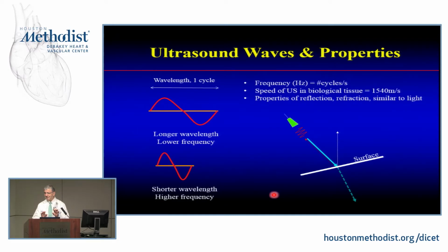And that's why it's so important for you to understand it, because quite a bit of that energy is going away. And it's going to hit different structures, and the structures are moving, so they're going to bounce over each other. And at times you may see reverberations, you may see mirror imaging, you see other things. Basically, you're sending these pulses of ultrasound in this medium, and this chest wall, and this abdomen. And it's amazing, actually, that we could discern various structures within these various cavities. Okay, so that's the principle.